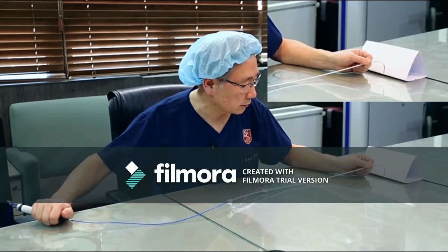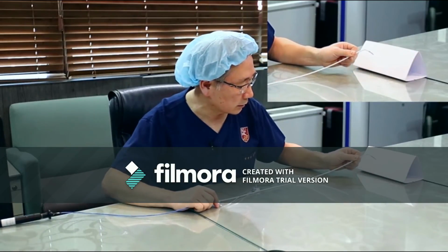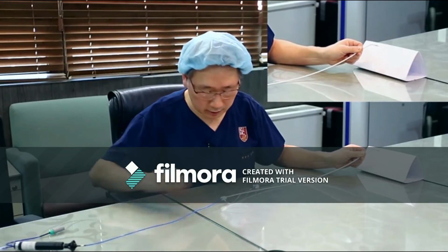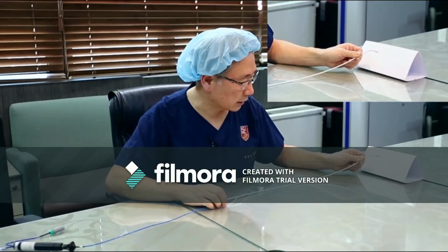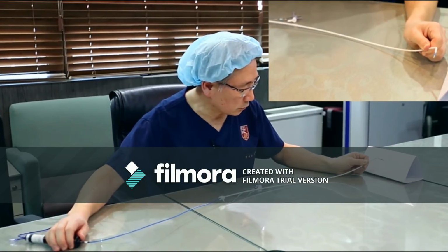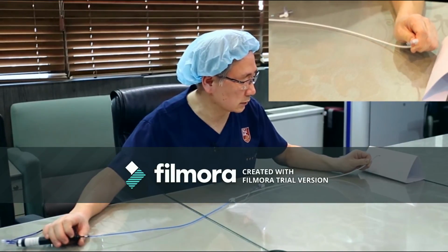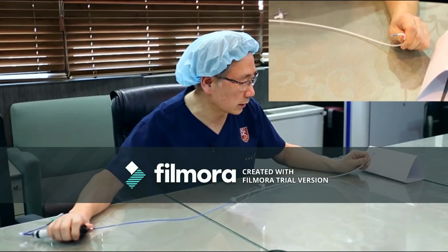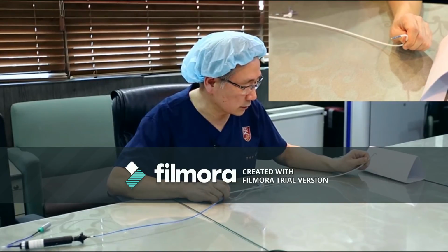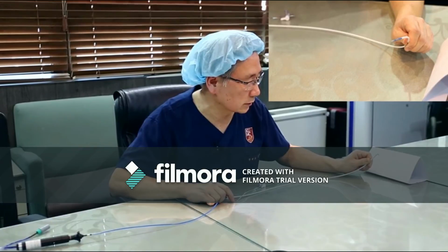How about the anterior wall? Clockwise, and then insert, and do the ablation here, here, like this. This is linear ablation.